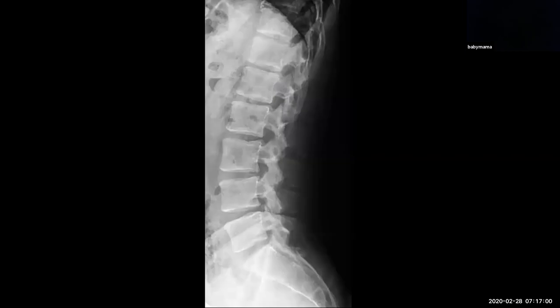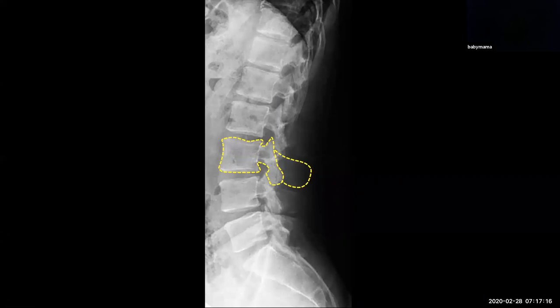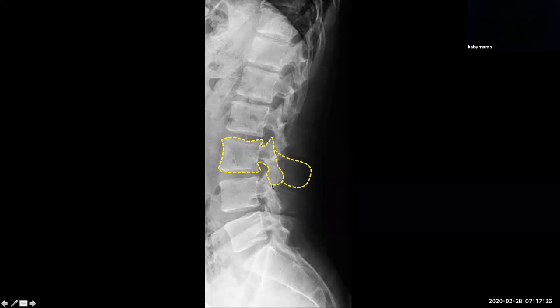Moving to a lateral view, we can do a similar thing. This would obviously be the vertebral body. The pedicles — or the eyes of the vertebral bodies — on this summation of shadows, we see the lateral view of the eyes. Here are the superior and inferior articular facets. And here, previously shown as the nose, on the lateral view this is going to be the spinous process of the vertebral bodies.